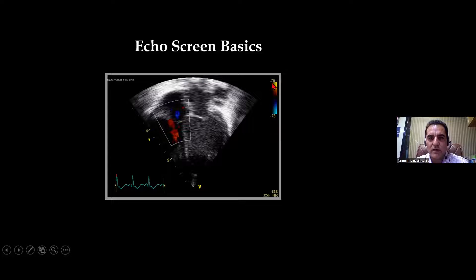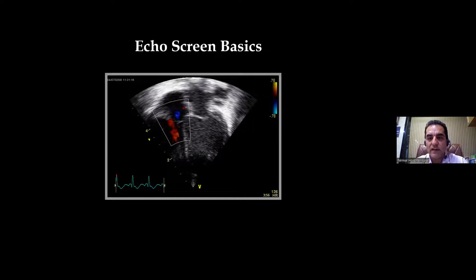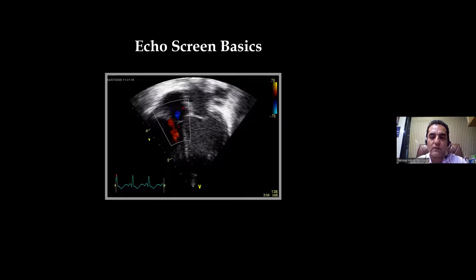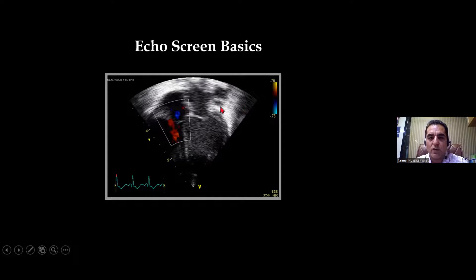When we do color Dopplers, this is the color velocity scale — it gives us the range. If I'm doing color Dopplers of an arterial system like the aorta, the velocity of blood in the aorta will be high, so I have to keep the range matching that velocity. If I keep the range too low, the actual velocity will overshoot it and appear as turbulence. If I'm doing Dopplers of the pulmonary veins, which is a venous system, I have to decrease the range — if I keep it high, I will not be able to see the venous blood flow.